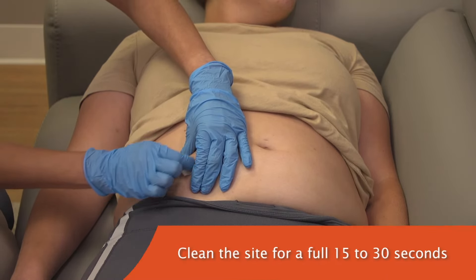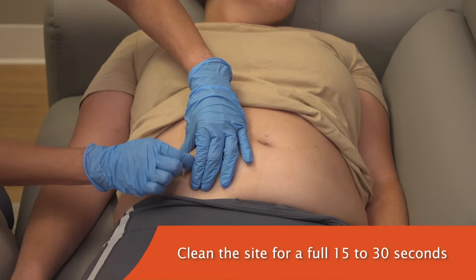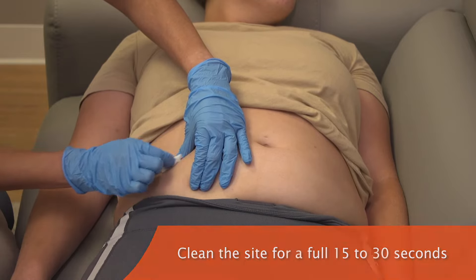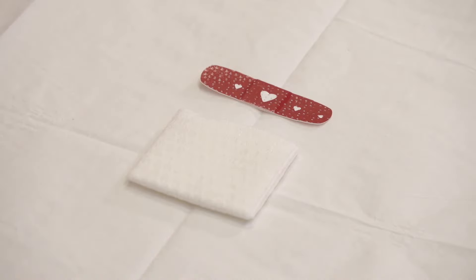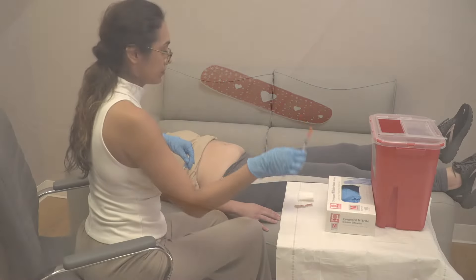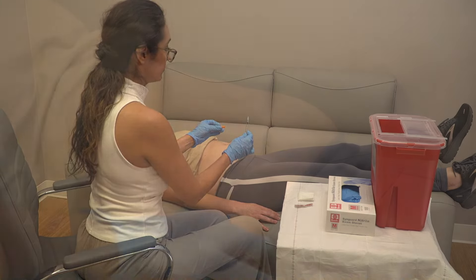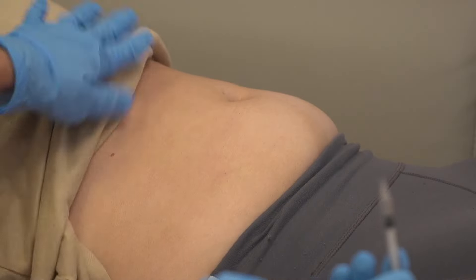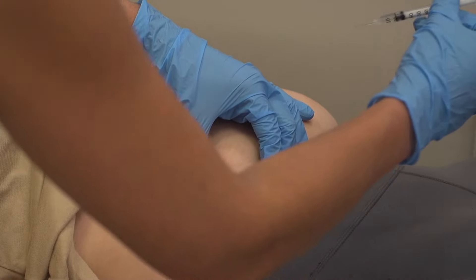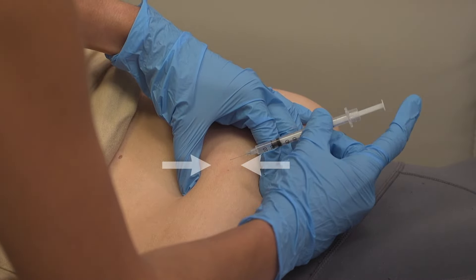Now that you have located the injection site, clean it for 15–30 seconds with an alcohol wipe, then let it dry. Prepare your gauze and bandage and have them ready. Remove the cap from the needle and discard. Before giving the injection, use your thumb and index finger to pinch a 2-inch fold of skin, which pulls the adipose tissue up from the muscle.